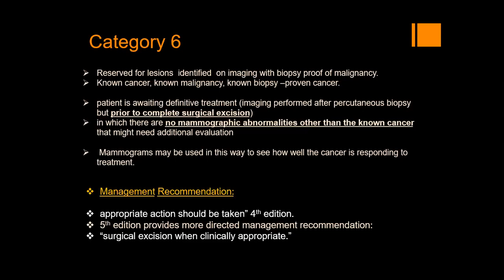And in which there are no mammographic abnormalities other than the known cancer that might need additional evaluation.